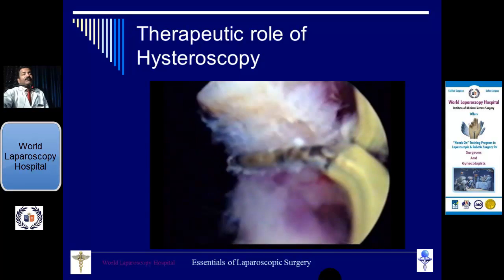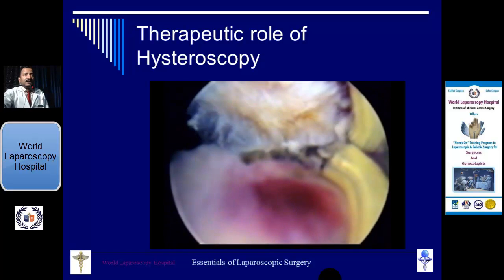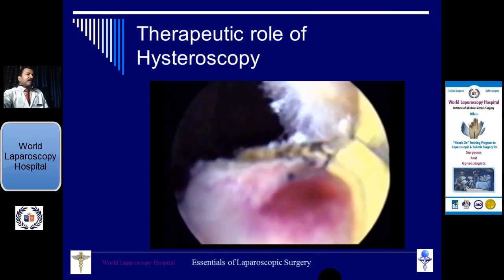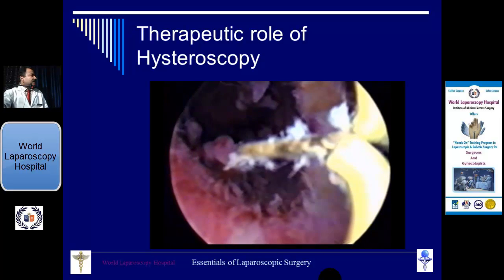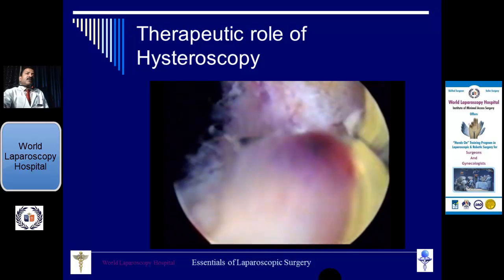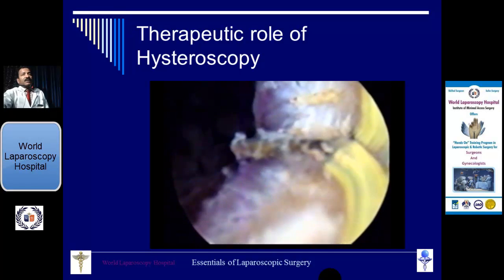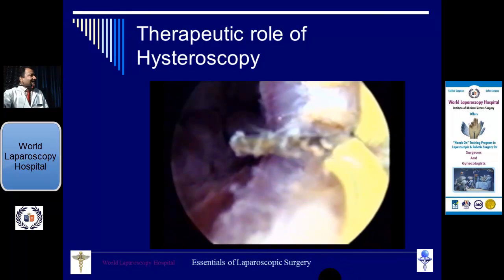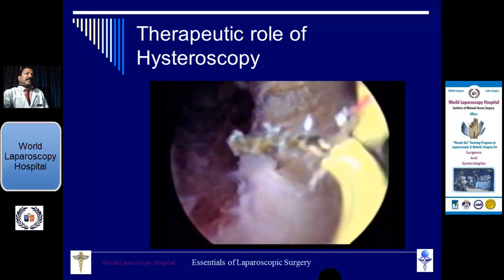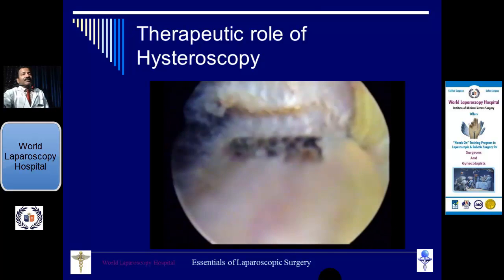And sometimes if the laparoscope is from above, it gives you the transillumination, and with this transillumination we can visualize it better. That will have an additional advantage. Many gynecologists during any operative procedure keep one laparoscope from above, so that they are sure about the transillumination, and that light helps. Now you can see the septa is much thicker, and then it has to be taken in the step ladder fashion, and then in the middle only it will be a split.